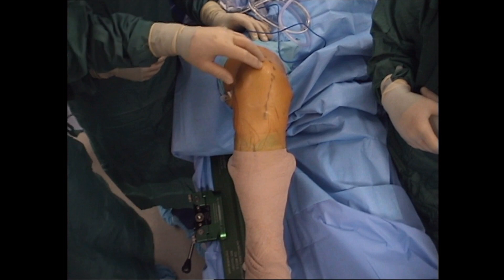Today we'll be demonstrating the TJO Classic Cementless Knee System.